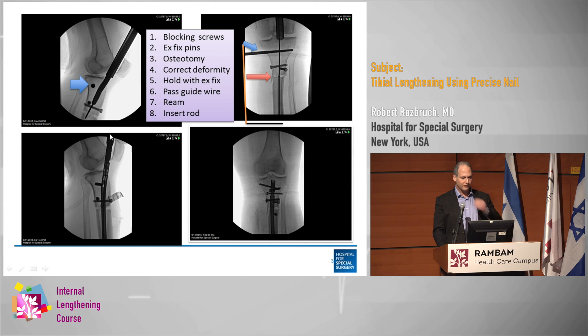This happens to be a suprapatellar approach, which has the advantage of allowing the procedure in the semi-extended position. It looks very busy because there are a bunch of blocking screws above and below, but that's the situation.